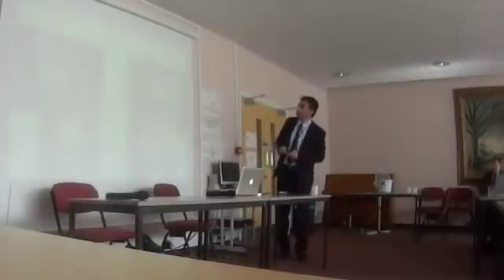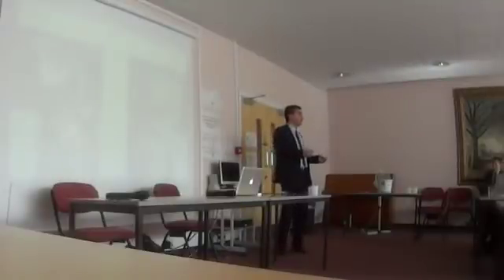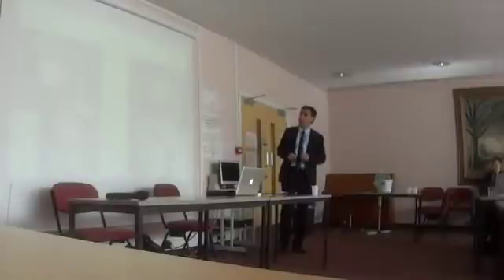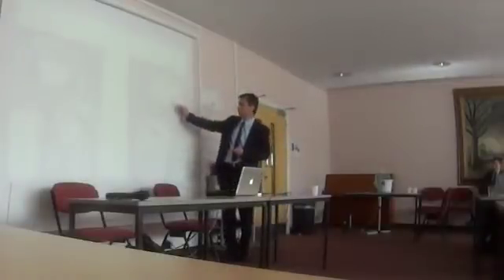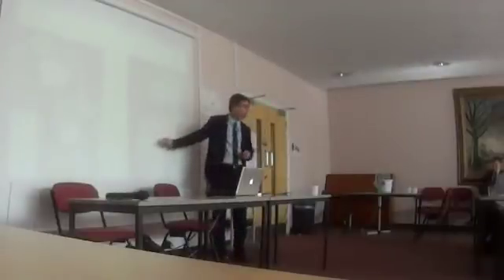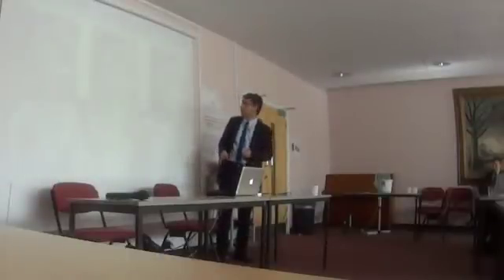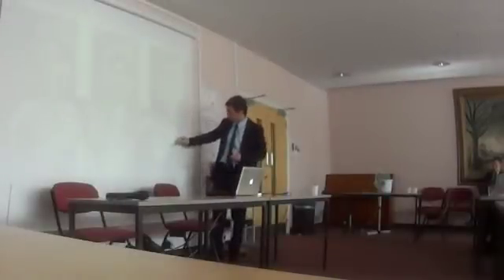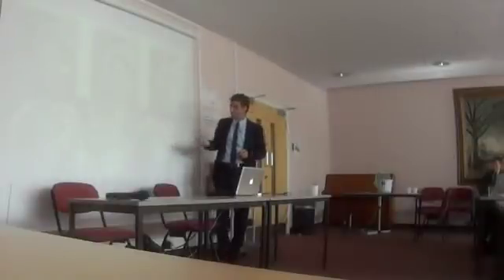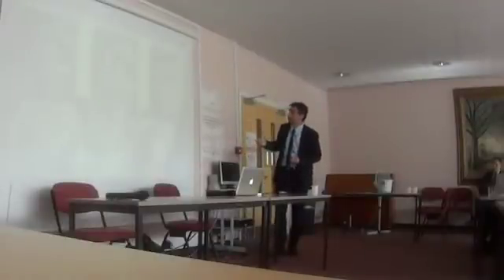So that was him. And this is a patient, again, admitted to our ward with ventricular tachycardia. Like I said, this is the arrhythmia session, so we'll talk about AF and arrhythmia. Again, LV function is not too bad. It doesn't project as good, but there was a certain area which is not contracting as well as we expected. It is what we call the lateral wall. And when we apply the gadolinium for scar detection, you can clearly see there's a scar there. Can you see the white? Mm-hmm. Yeah. So this is the white. That's a scar. That's here.